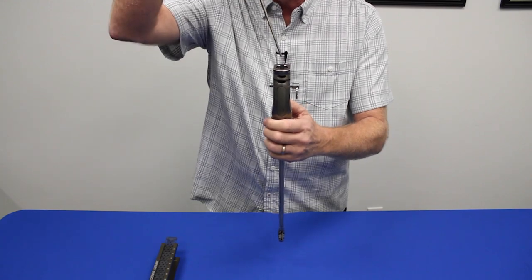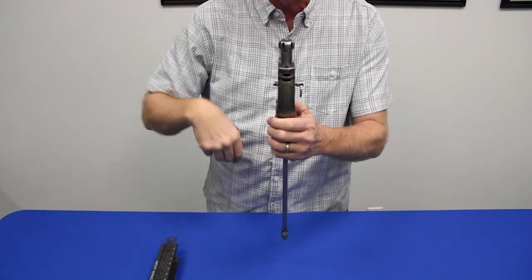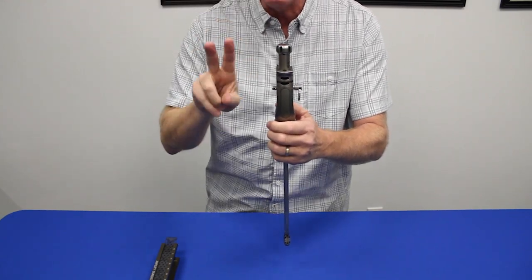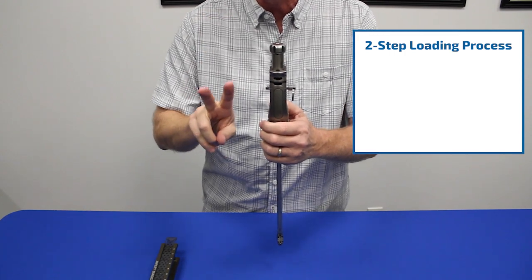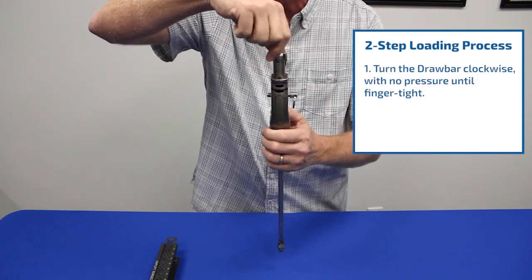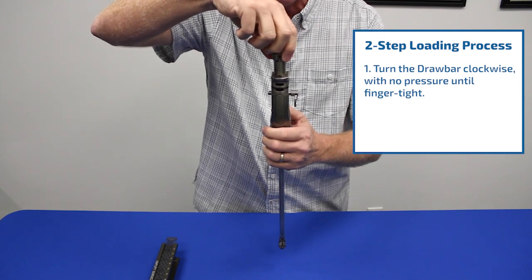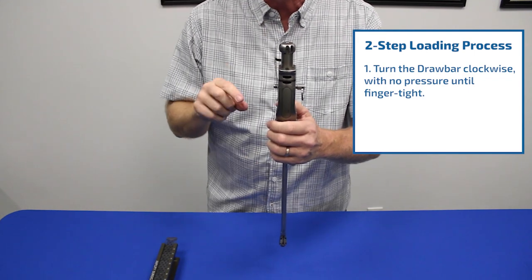We want to take the draw bar and drop the draw bar straight into the handle. This requires two distinct steps. The first one is to turn the draw bar with no pressure, just the gravity that you're using there. Finger tight.